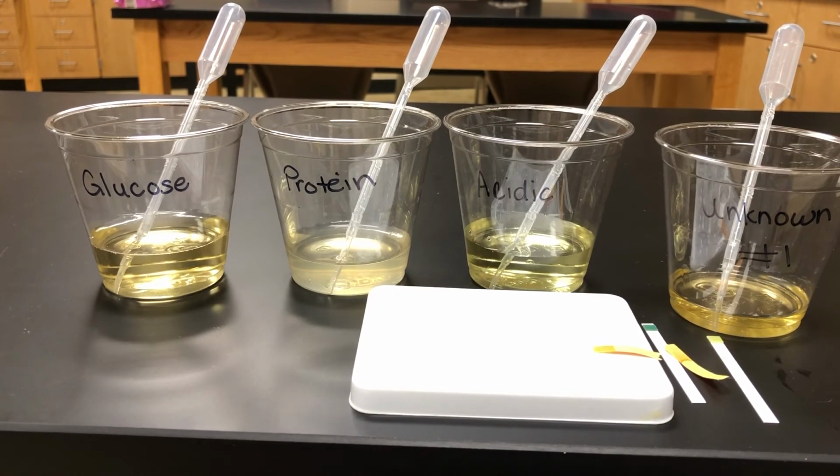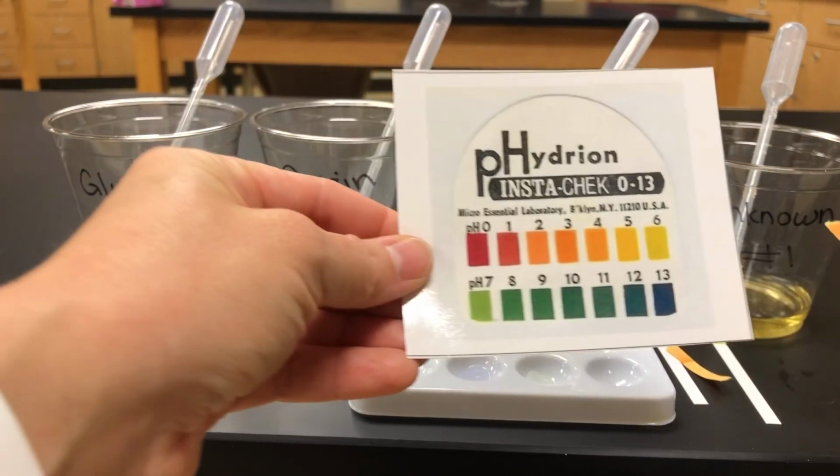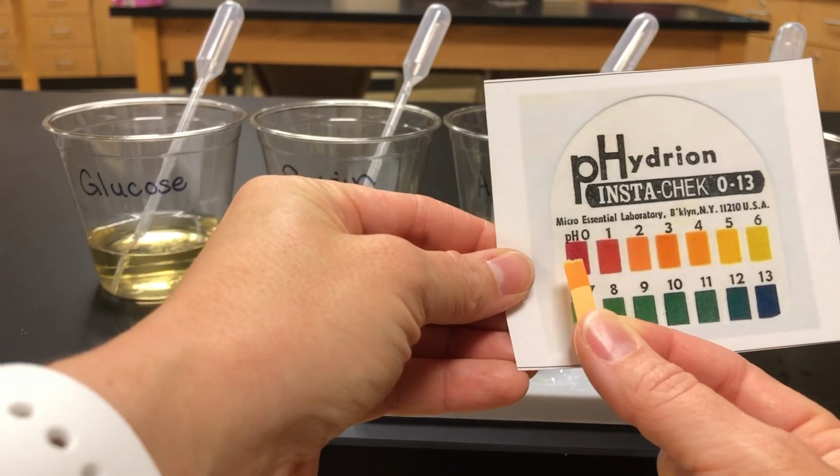Okay, so let's give this pH paper another few seconds and we'll take a look at it, and then that'll be the data collection for this lab, and you guys can do the rest of it on your own. All right, so again, this is testing acidity with our pH paper.